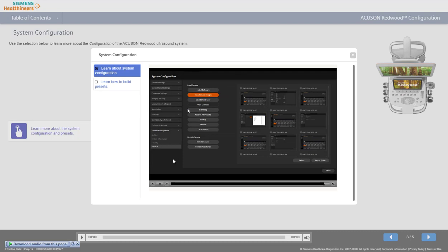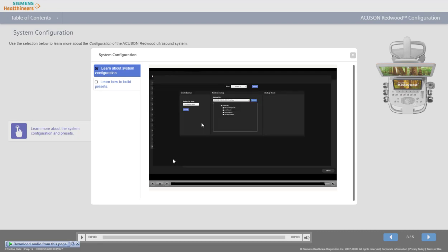To restore the system from a previously created backup file, select the Restore icon. Select the source from the drop-down menu. Then, select the file. The options for Restore are listed below the file name. The ultrasound specific area contains submenus that may be opened by clicking on the text. Select the appropriate options, then select Restore. Select Next to continue.